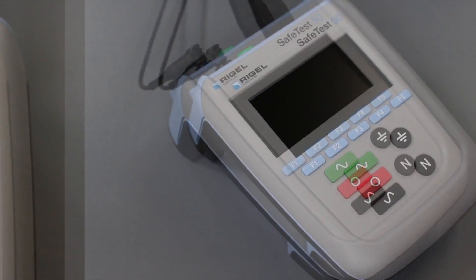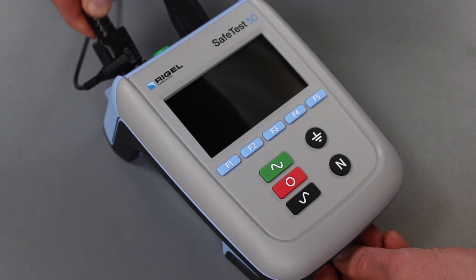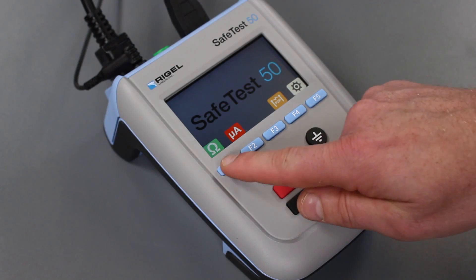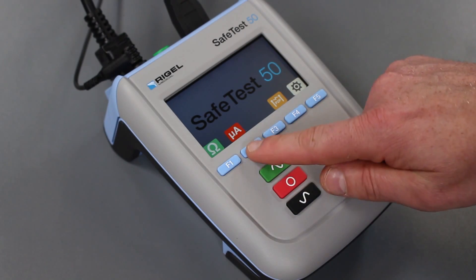Testing is fast and simple with rapid boot-up, as well as an easy-to-navigate color screen and dedicated function keys for performing reliably accurate ground bond, leakage, and point-to-point testing.